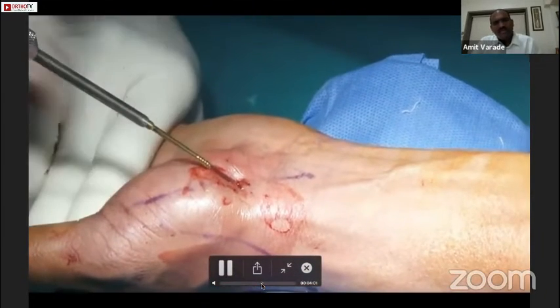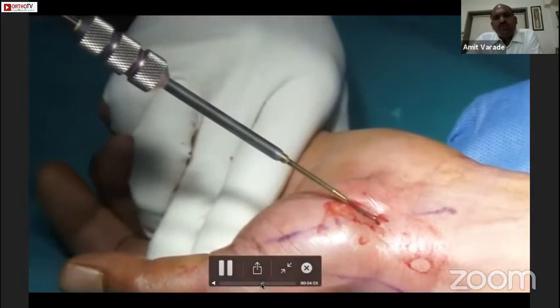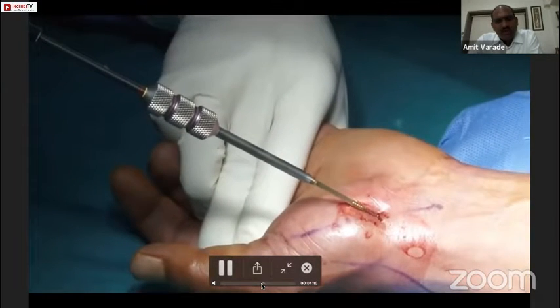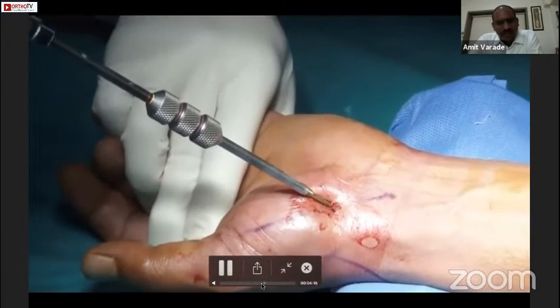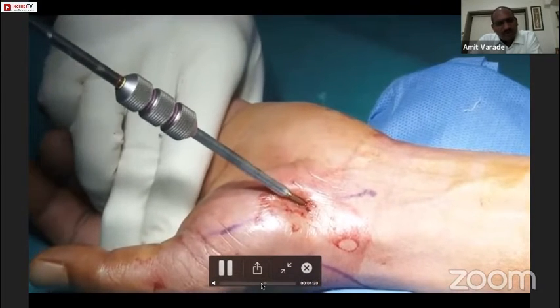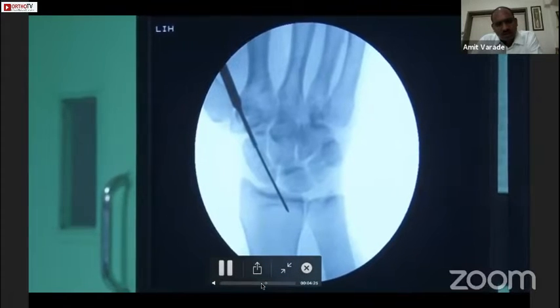After drilling, we pass the headless compression screw. This is the specialized screwdriver that comes with the set. There are three markings at the top — green, yellow, and red. When it is at the green mark, it means the sleeve is engaged into the head of the screw.